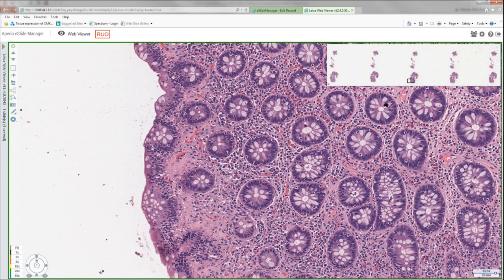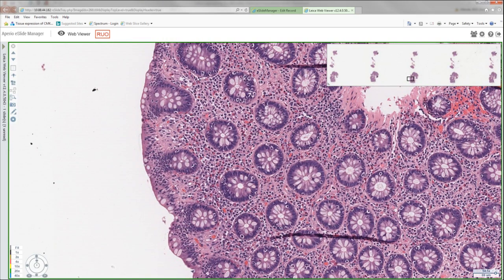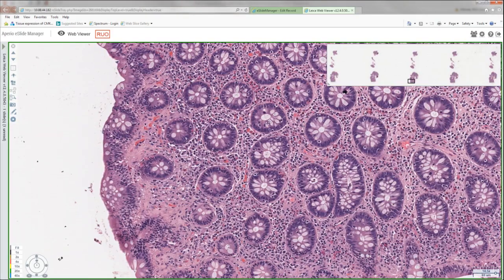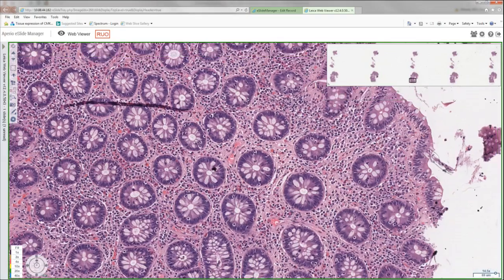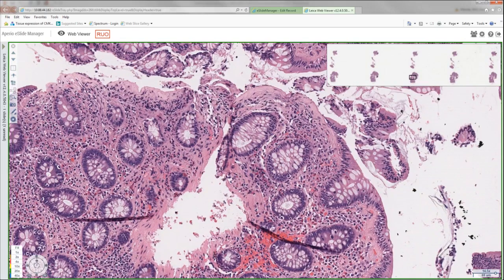As opposed to the previous case, I think in this case there's a much more striking picture of intraepithelial lymphocytosis. So you can see all the lymphocytes attacking those crypts. They're also present in the surface epithelium. The surface epithelium goes from areas that are more intact to areas that lose a little bit of the goblet cells, so more reactive. In addition to that, this case, and let's see if we have a better view here, has denudation of the surface epithelium, which is a frequent finding in some of these cases that are more severe.